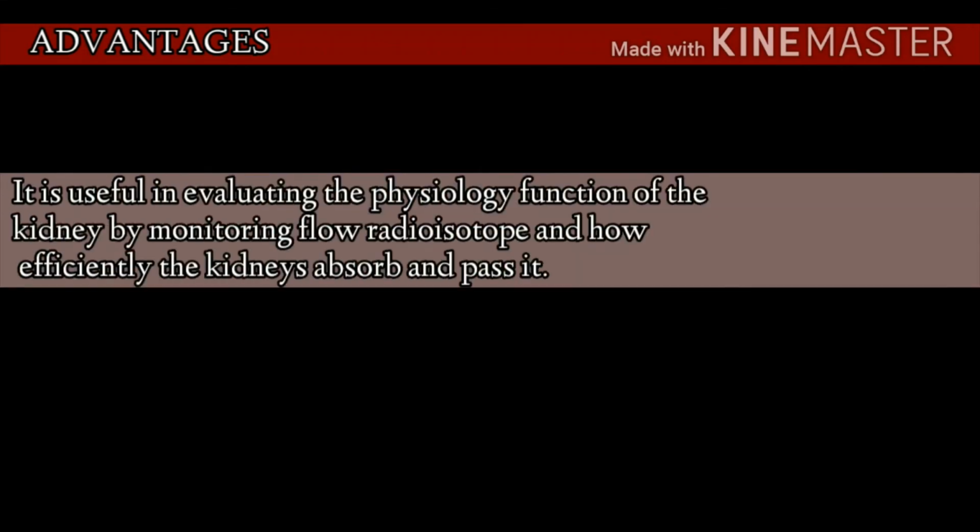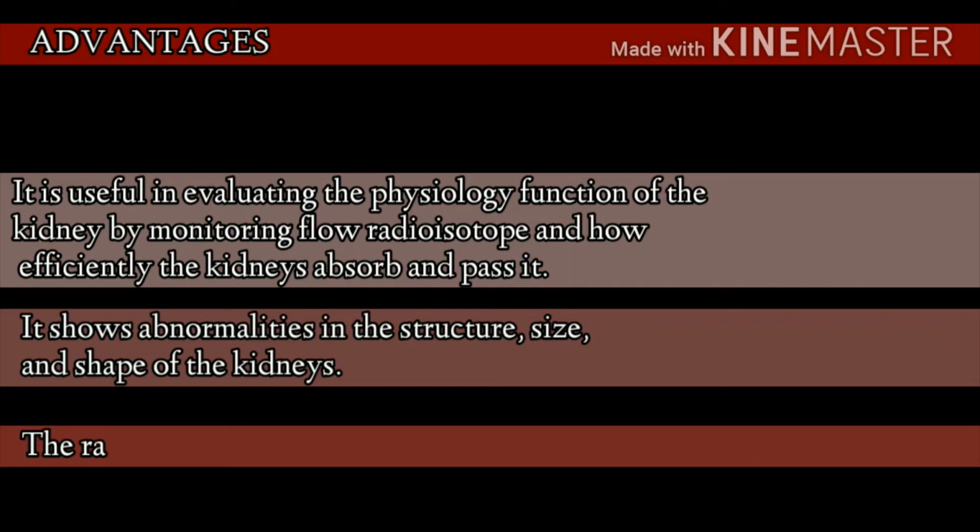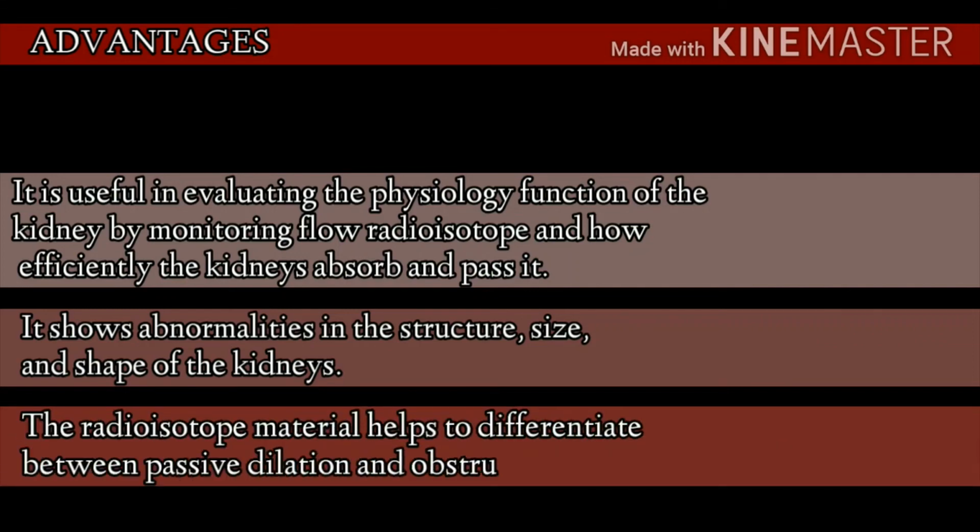Advantages. It is useful in evaluating the physiological function of the kidney by monitoring flow of radioisotope and how efficiently the kidneys absorb and pass it. It shows abnormalities in the structure, size and shape of the kidneys. The radioisotope material helps to differentiate between passive dilation and obstruction.